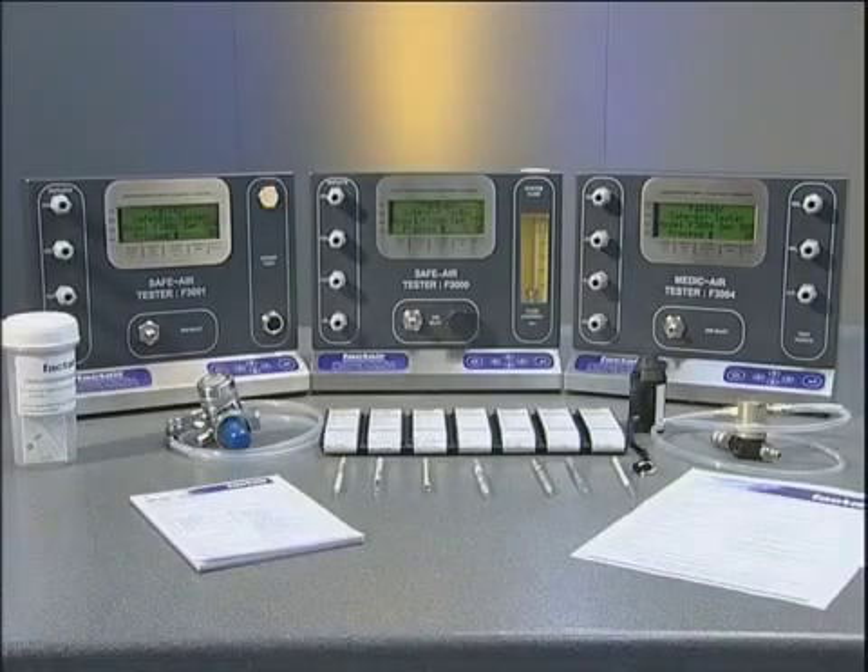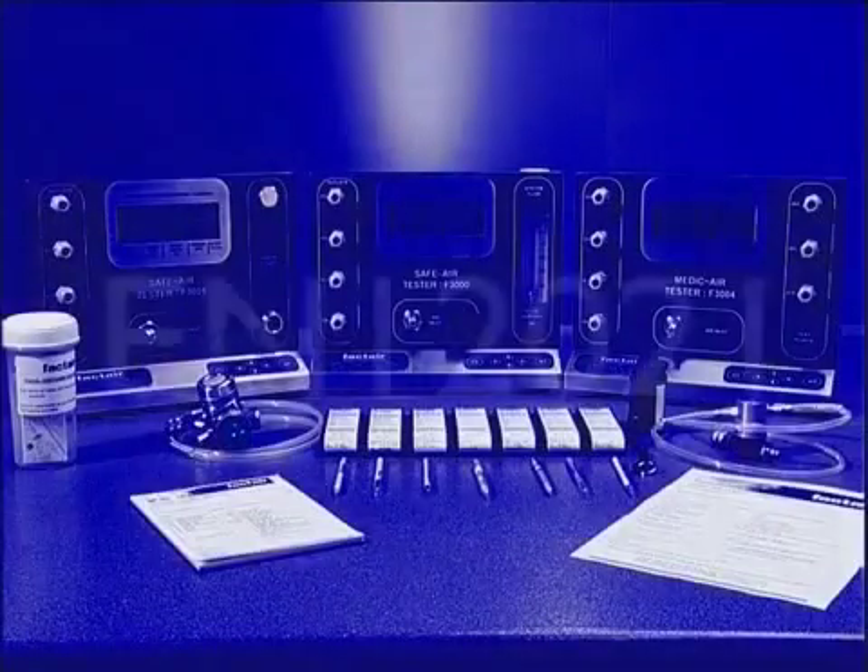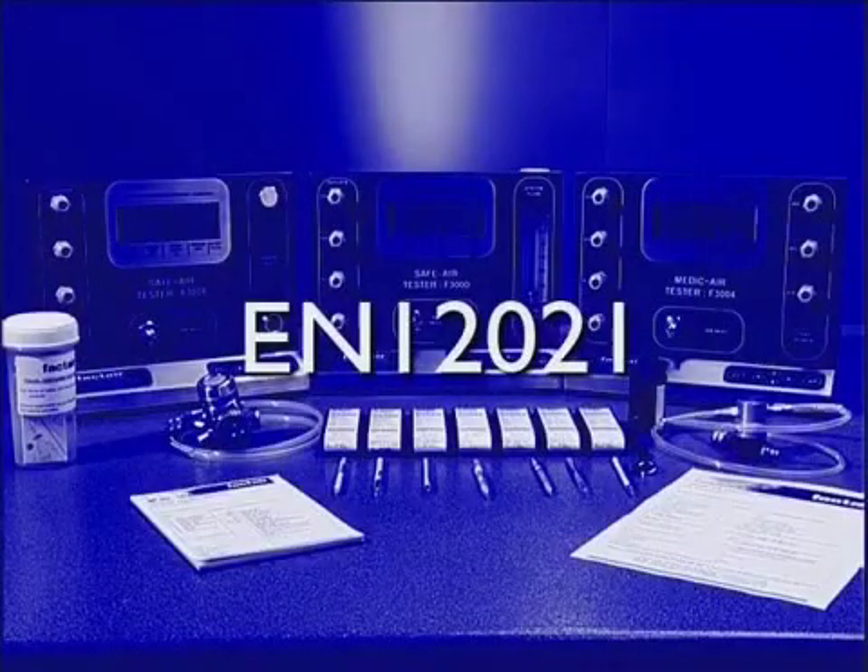Safe air testers are designed to provide a quick and easy method to carry out accurate periodic testing of breathing air supplies. The European standard for breathing air quality is EN12021, which should be referred to in conjunction with any overriding national standards.